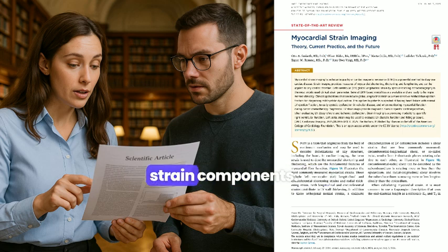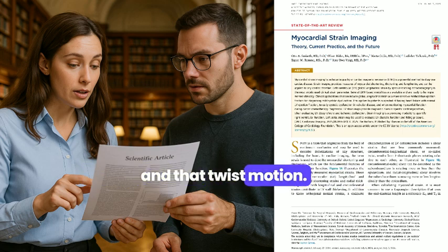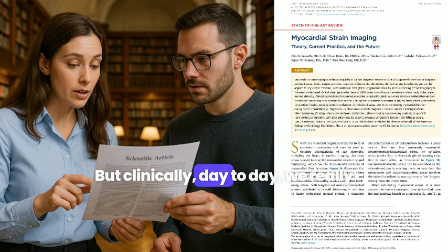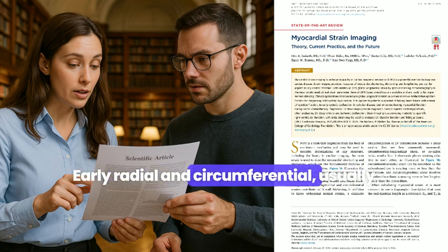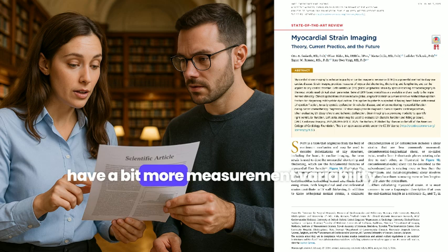Let's talk about the different strain components, longitudinal, radial, circumferential, and that twist motion. Okay, so a full 3D picture involves all three main strains plus those shear strains. But clinically, day-to-day, we really lean heavily on longitudinal strain. Right. It's just proven to be very sensitive. It picks up problems early. Radial and circumferential, usually measured from short axis views, tend to have a bit more measurement variability.